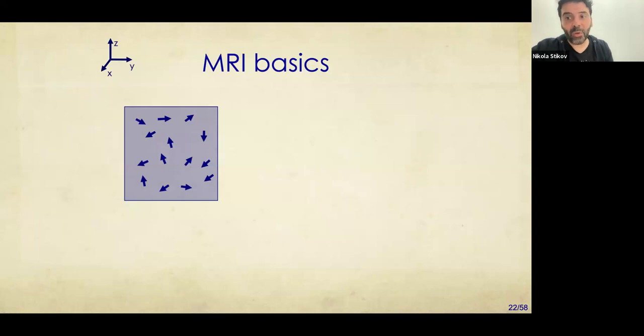So rather than say we have spins up and spins down, and a magnetic field makes all the spins slightly more preferential to the up direction, we say, you know what? Each of these spins are little magnets. And when you put them in a magnetic field, they will try to slightly align with the magnetic field, just like that. Okay? So it's not very noticeable.